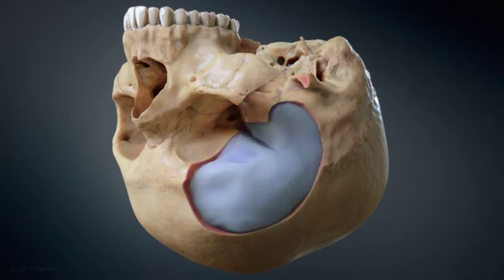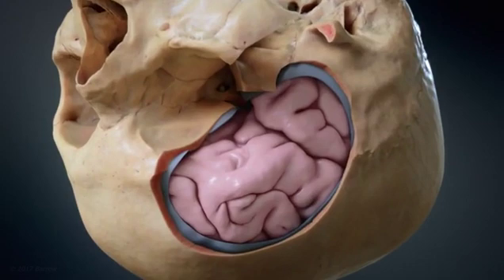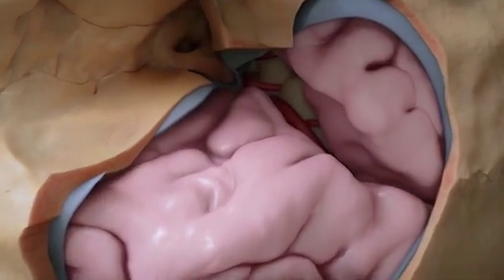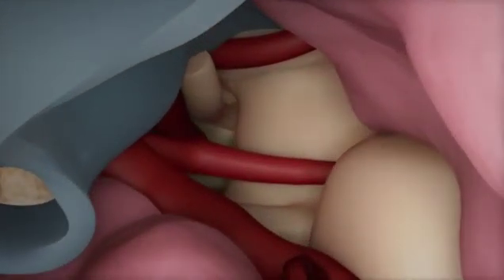Removal of the pterional as well as the orbitozygomatic units allows for exposure of the frontotemporal regions, giving the surgeon both a subfrontal and subtemporal access to the posterior fossa contents that may be necessary to approach lesions in the brainstem. After splitting the sylvian fissure widely and releasing spinal fluid from the basal cisterns, the surgeon arrives upon the membrane of Liliequist. Opening this membrane provides an excellent view into the posterior fossa. This can be used to approach the midbrain and upper brainstem structures.